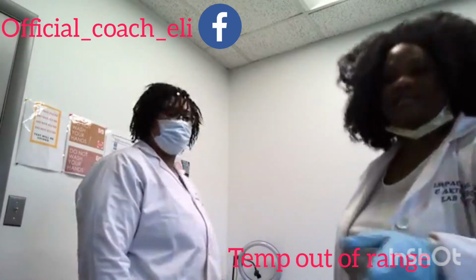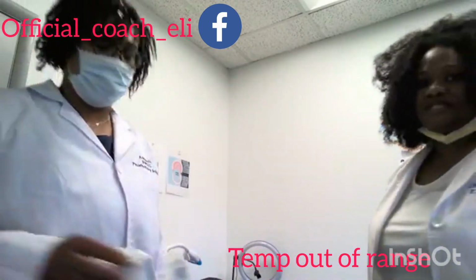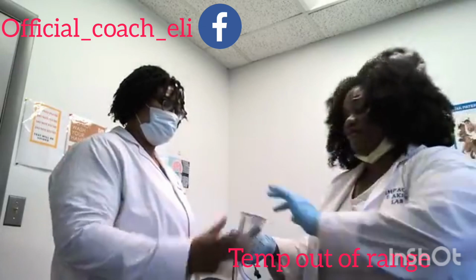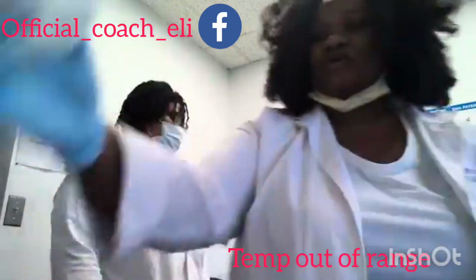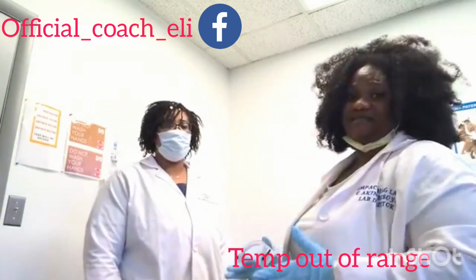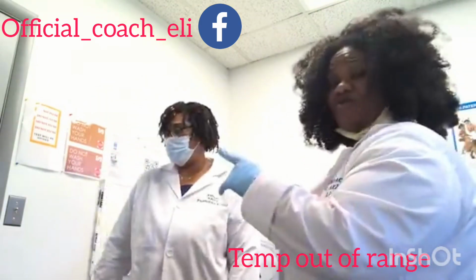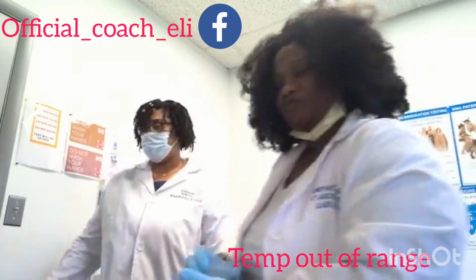So I'm going to then ask her to select a cup. Can you please select a cup? All right. Then she's going to go ahead and break the seal. Can you break the seal? Once the seal is broken, I'm going to give her the same instructions. Then we're going to actually have to go together at this point. So I have to go with her to the restroom. She's going to void in the cup. One moment.